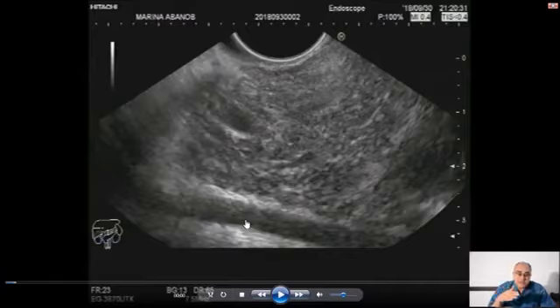The examination, as I mentioned before, is clockwise and anti-clockwise. When I do clockwise, after seeing the portal venous confluence, I can do more and more clockwise to see the aorta and inferior vena cava. Then I start to see the superior mesenteric artery, and then by some clockwise I can see the venous confluence, and in front of the venous confluence is the common bile duct, and then more and more clockwise I can see the aorta and inferior vena cava.